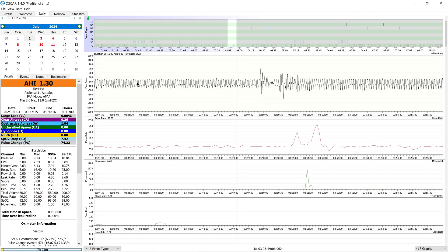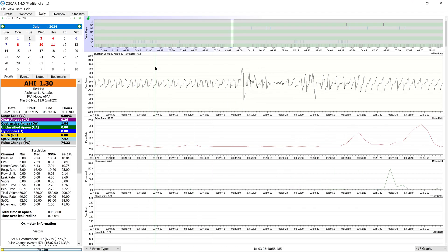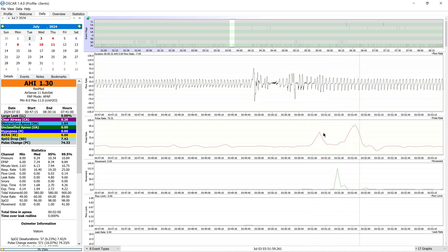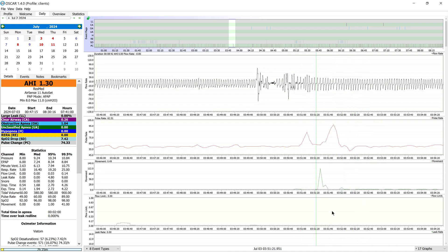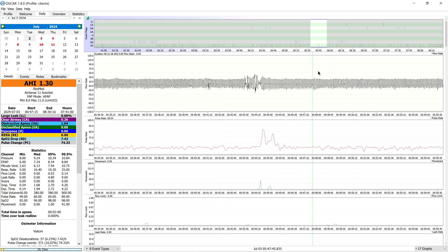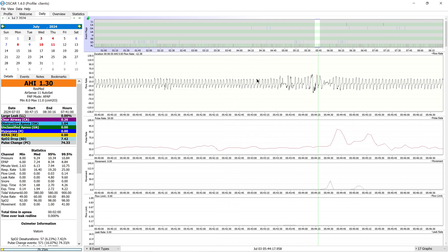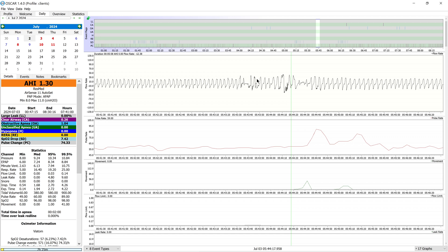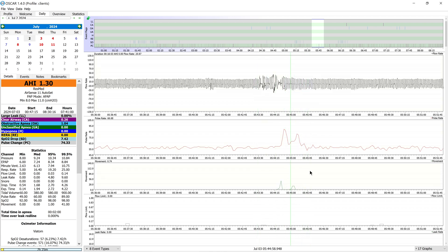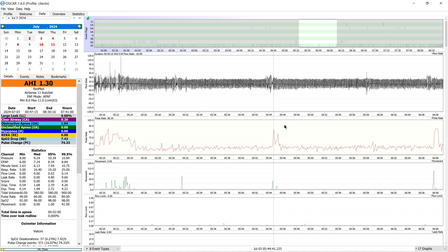One of my clients I work with one-on-one was nice enough to share his data, which I thought was a perfect fit for this video — shout out to him, you know who you are. Here is example number one. We have clear indications of flow limitation, a huge recovery breath, sleep-wake-junk type breathing, and a pulse spike with movement and no considerable leak. Same thing here around 5:45 a.m. — you can see much of the same: flow limitation, then a signature of sleep-wake-junk with a coinciding pulse rate spike and movement. Probably woke up here, though OSCAR didn't count this as anything.